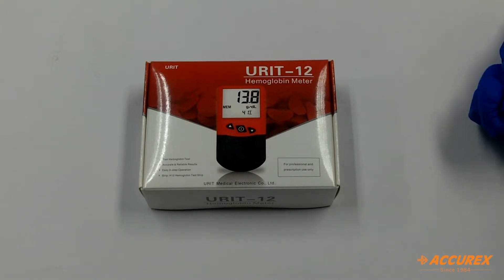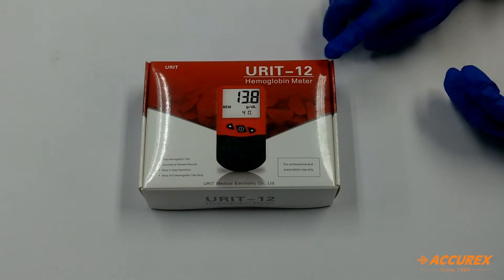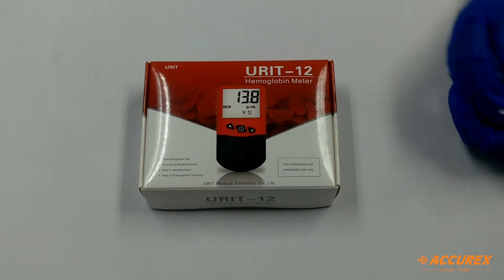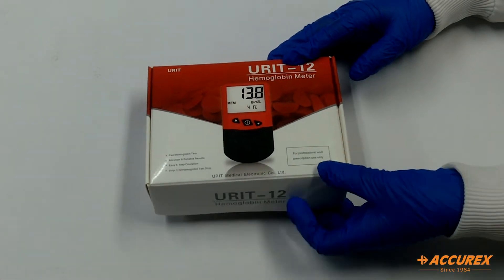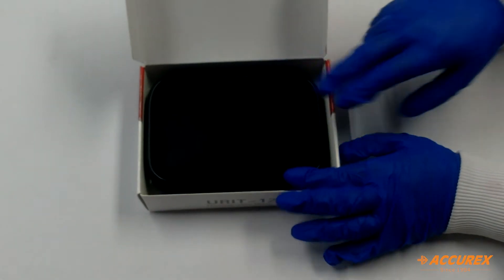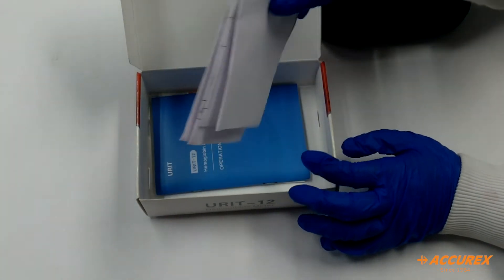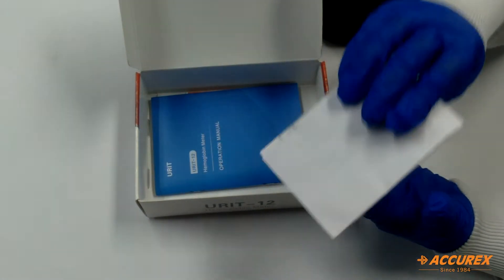Hello everyone, greetings of the day. Today we will see the Accurex haemoglobin meter, which is the URIT-12 haemoglobin meter. First we will see what accessories come with this meter. So we will open the box. There is a black pouch and here there is the packing list given, with all the accessories mentioned.